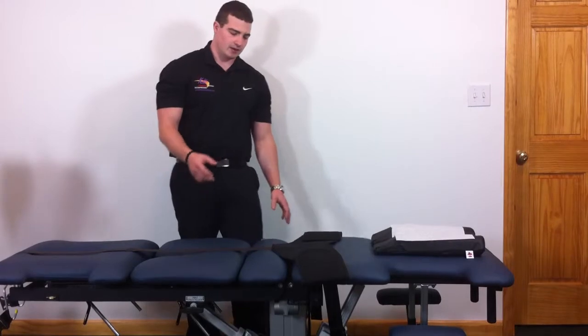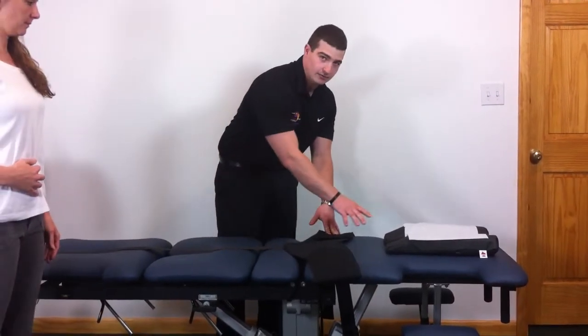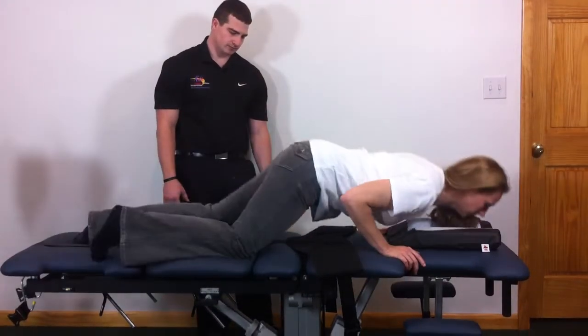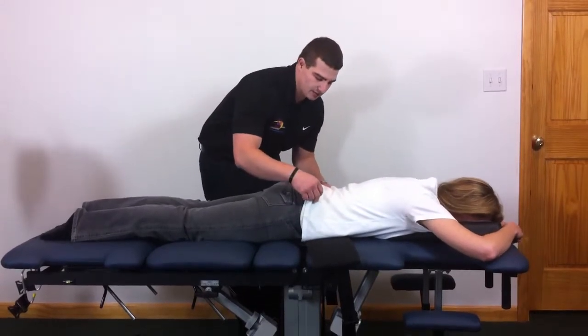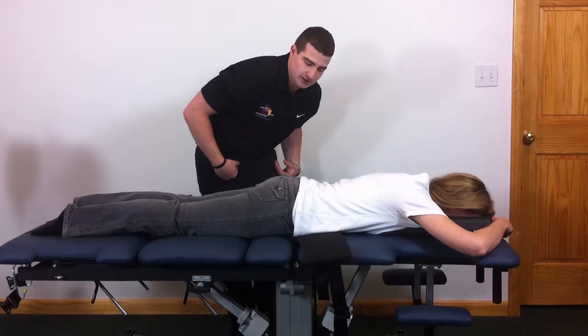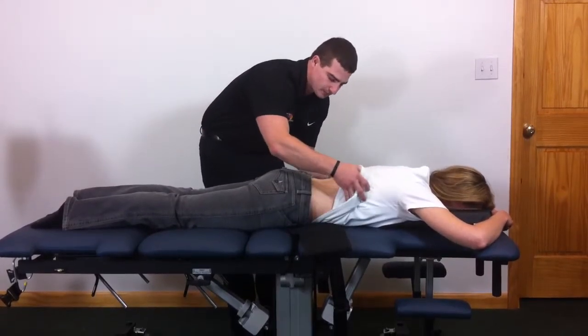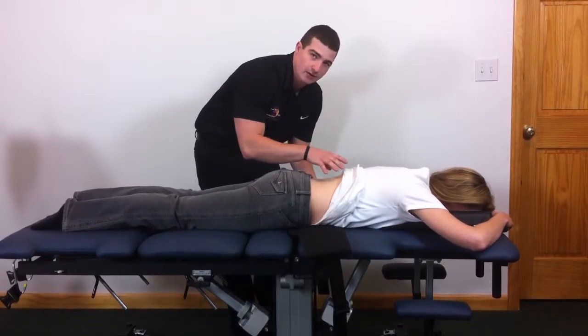Have your patient come in the room, have them point their belly button towards the center of the belt and lie down on the table. You want to make sure the patient removes their belt if they have one on, and have their shirt loose so you can pull it up. You want to expose the low back region at least from L1 to L5.